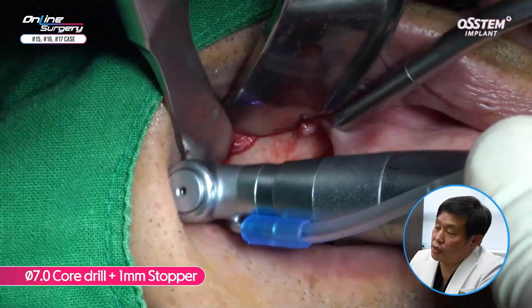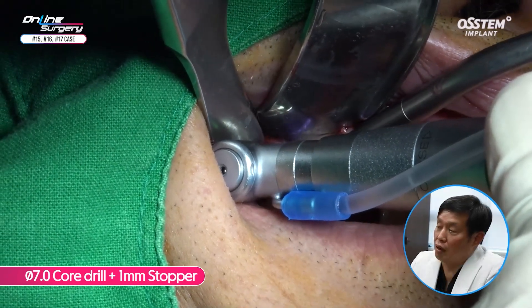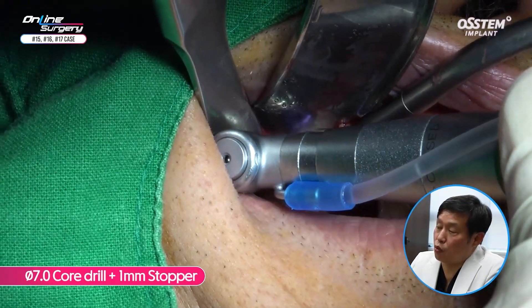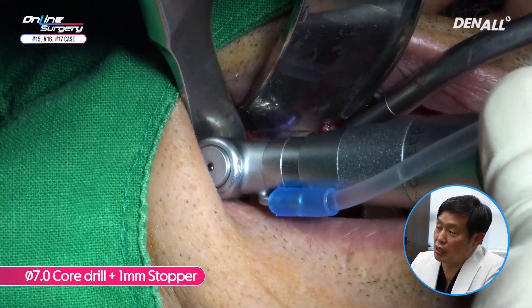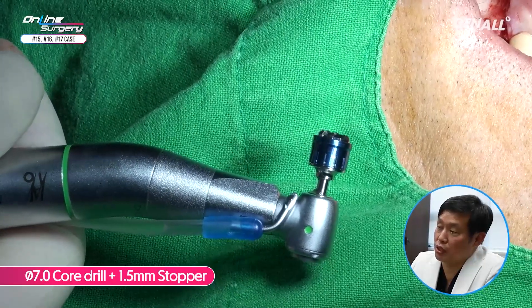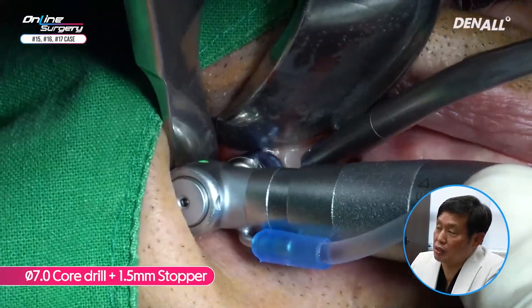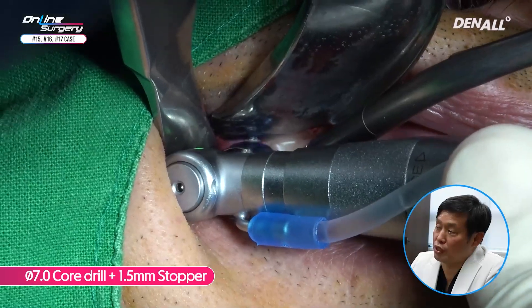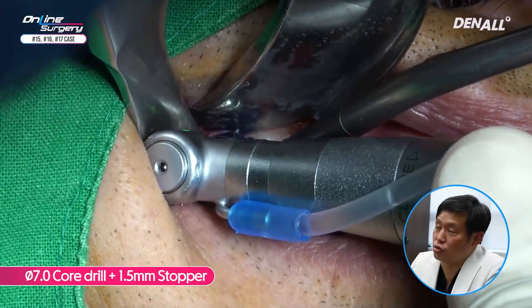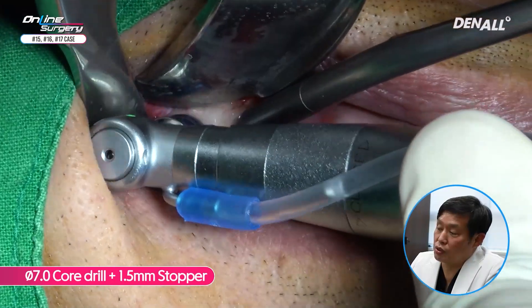A 7.0 mm diameter core drill plus 1 mm stopper is used to form the lateral window. As shown on the CT, there is intraosseous anastomosis on the lateral wall and a vessel was observed. I am trying to form the window slightly more mesial to perhaps avoid the vessel. When drilling and bleeding occurs, you should not try to stop the bleeding at that point — you need to form the window first and then stop the bleeding.